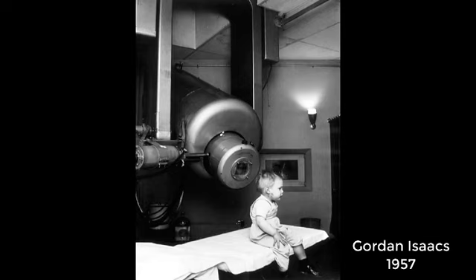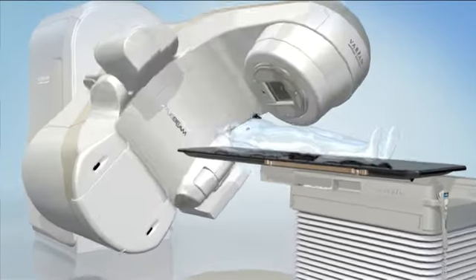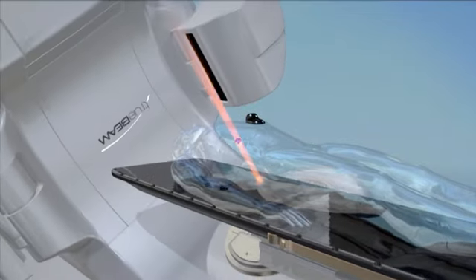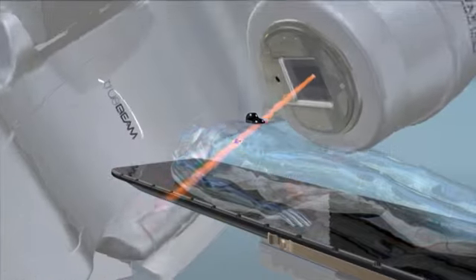And the technology continued to develop at the same time. In 1968, Varian released the Clinac 4, which was a C-arm linac-based unit. It wasn't the first isocentric unit. There was one in the 1950s in Newcastle and others, but this is the one that really became the workhorse for radiotherapy and established this type of engineering solution as the dominant one for many years. And of course, these units have advanced, and now there are many options and many bells and whistles, you could say, that help guide treatment and make it more accurate.